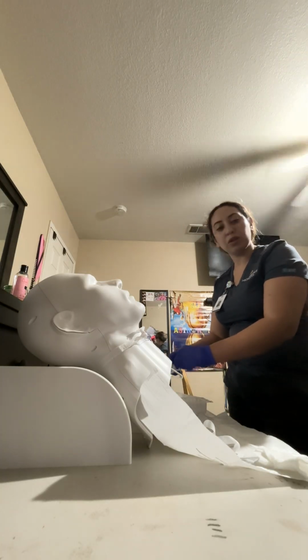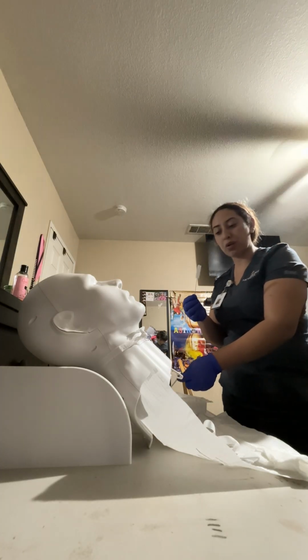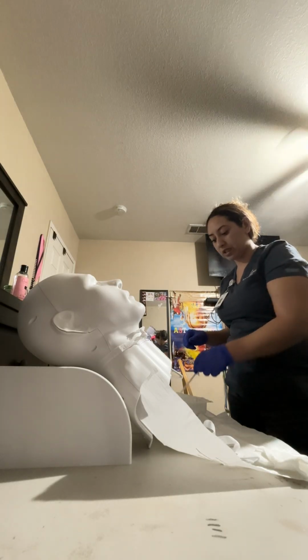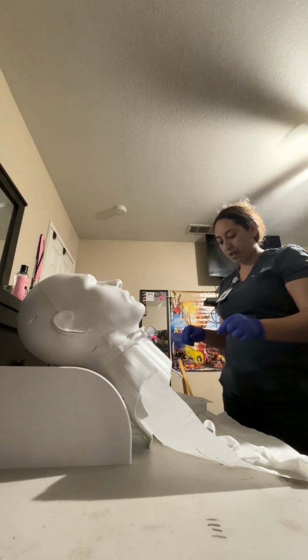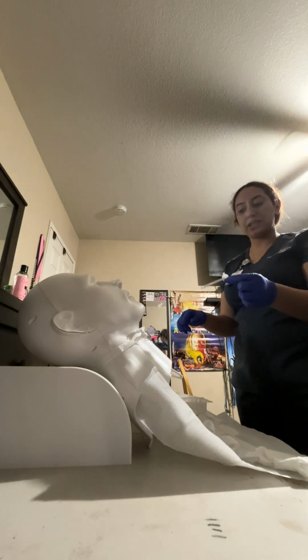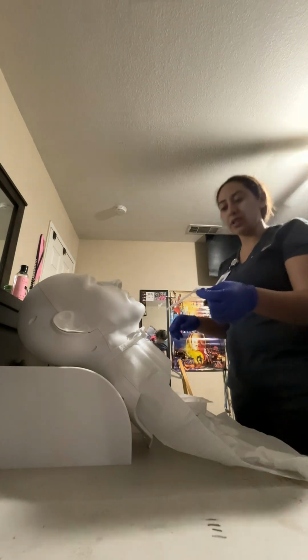Now that I'm done with using this brush, we're not going to keep it. We are going to toss it right into the trash. Okay. Going to place the clean inner cannula into some soaking solution. After that has rinsed and soaked, I'm going to remove that and let it air dry. Once the inner cannula is air dried, it is ready to go back to the tracheostomy site.